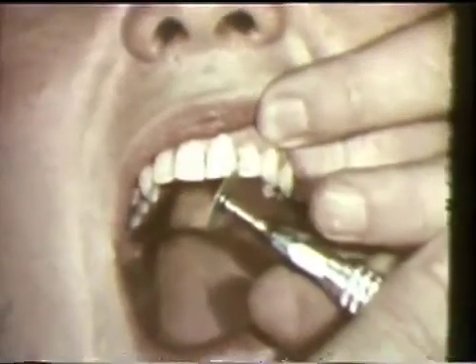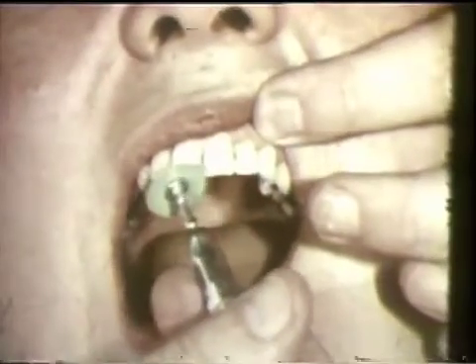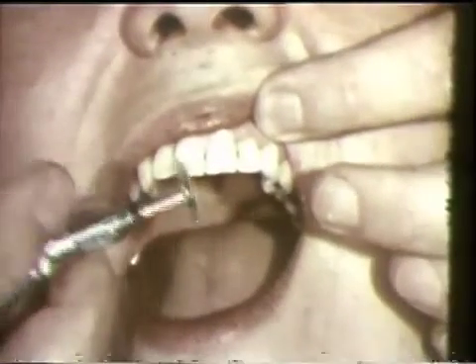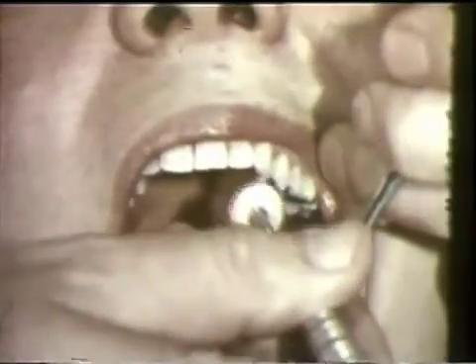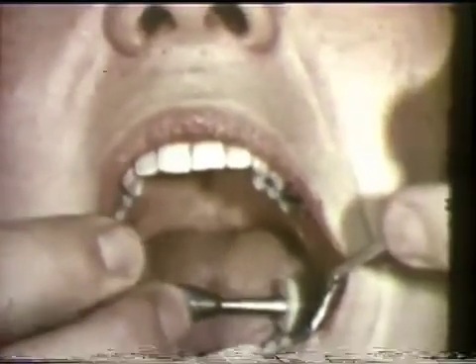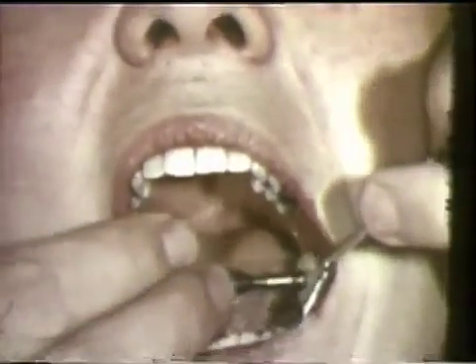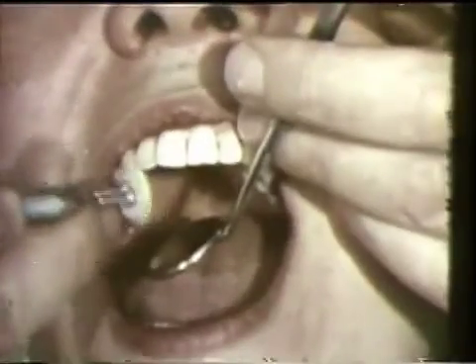The sharp edges on the anterior teeth are smoothed and polished to provide optimal aesthetic as well as functional results. The ground surfaces are polished with a rubber disc dipped in 2% sodium fluoride or 8% stannous fluoride solution to prevent sensitivity and to provide smooth gliding surfaces on the teeth. All occlusal surfaces should be carefully polished to enhance comfort following the adjustment.